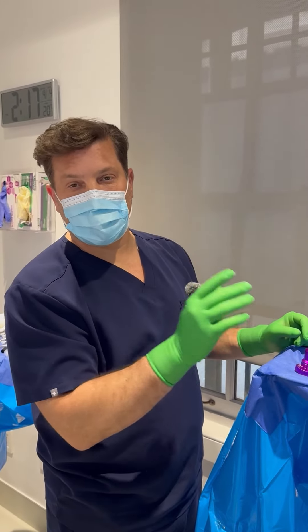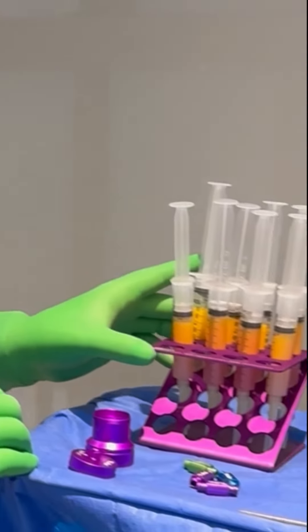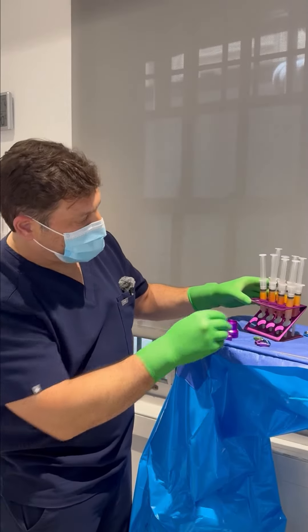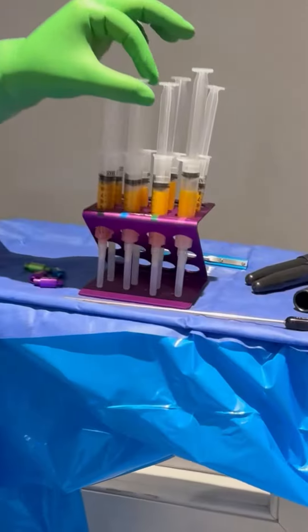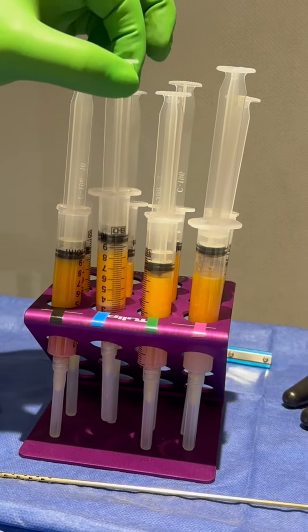We did the initial harvest — 80 cc's of fat from the gluteal region. First thing we're going to do is allow it to separate just by gravity. The ones in the back have been separating longer, and you'll be able to see that there's fat up top and saline and water down below.